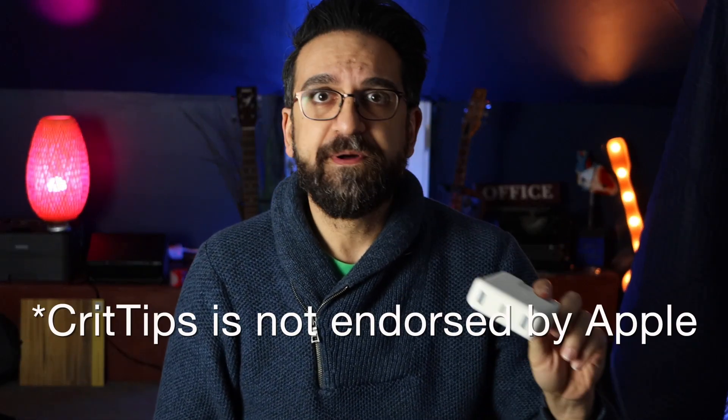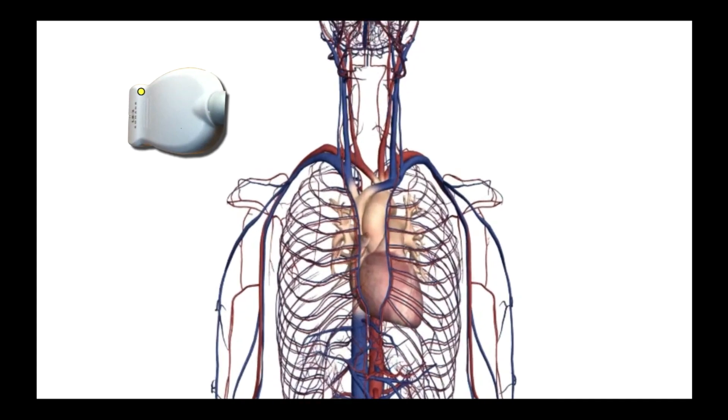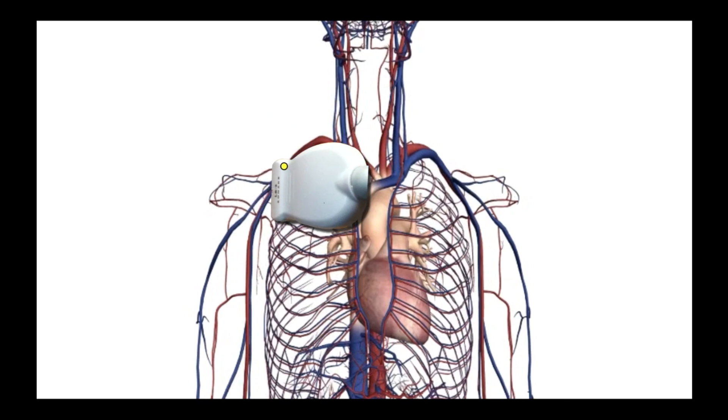Here's how we're going to do the procedure. We'll be using the linear probe, as we do for any vascular access, because the linear array of crystals allows us to put the vein in long axis — and that is the key to this procedure. With the marker up, we're going to plop and drop right here on the anterior shoulder, placing the probe there and then dropping it down just a centimeter or two until we see the axillary vein and axillary artery on our screen.